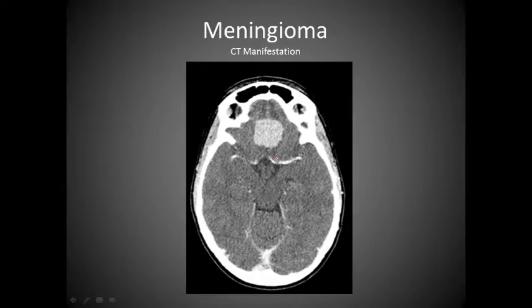Additionally, here's another meningioma. Notice it's on the midline as well. We have contrast enhancement coming in the arteries, and we have this area here, this mass. Typically, it almost looks the same as the one I showed you that we scrolled through, the olfactory meningioma. However, it's not as large. So it's pretty much in the same location, but notice it's not causing that much of an abnormality.